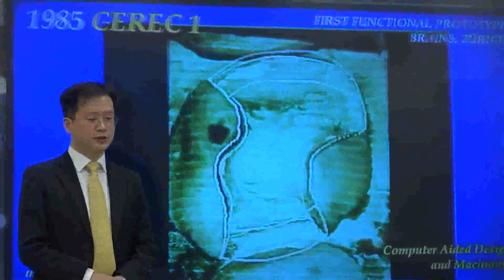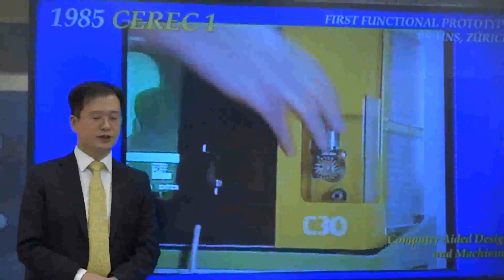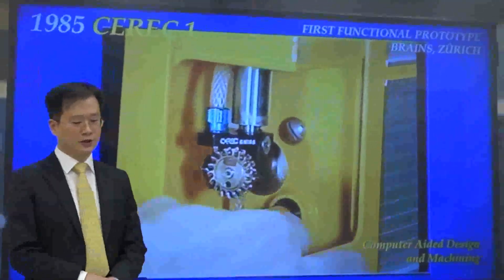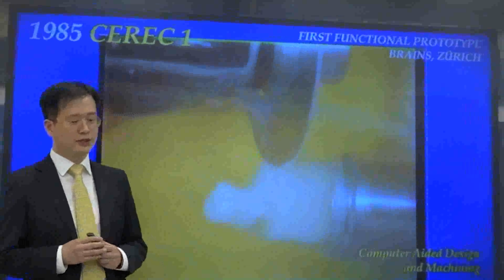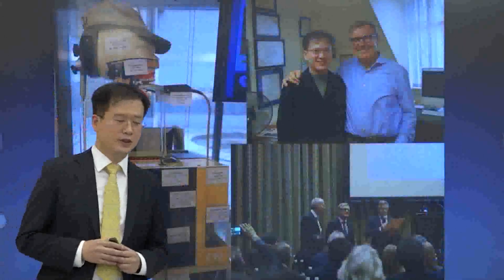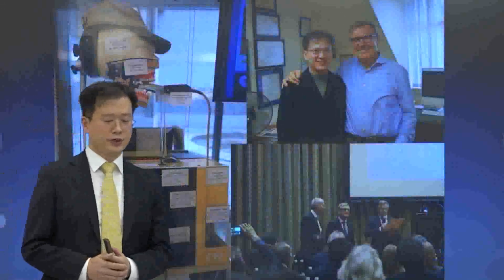At the time of its introduction, inlay design consisted of multiple layers of lines, not 3D graphics. Machining was also conducted with a limited form of discs. At present, many developments have been made. I have been working with the University of Zurich on an ongoing basis.